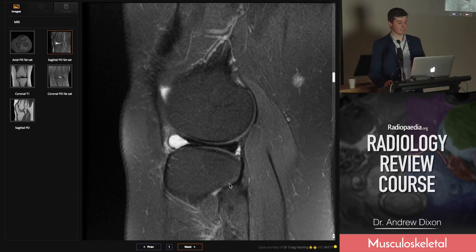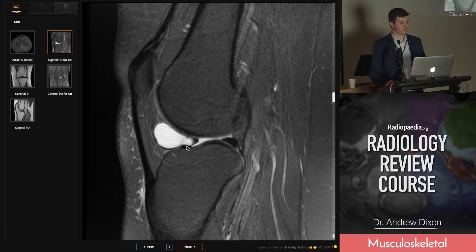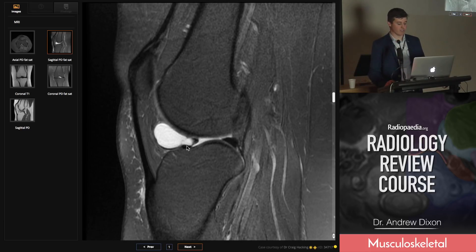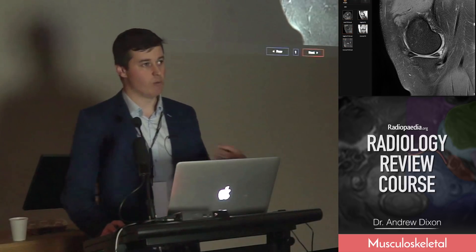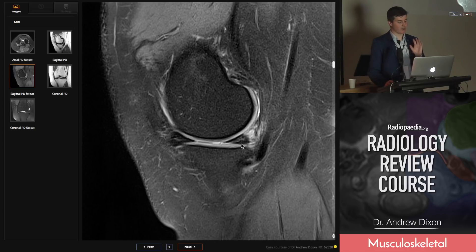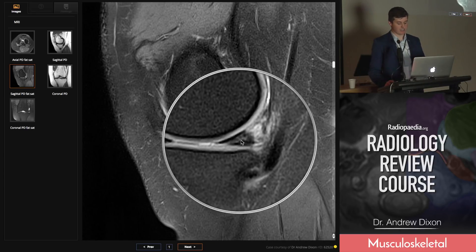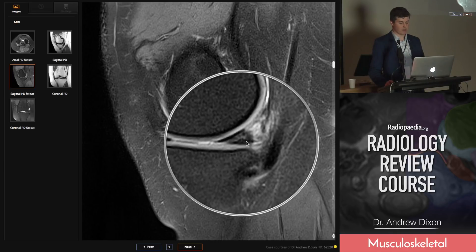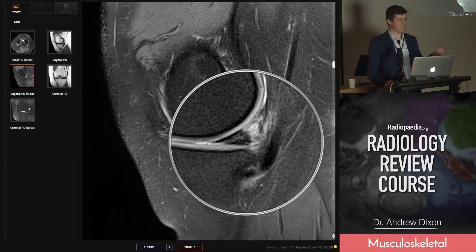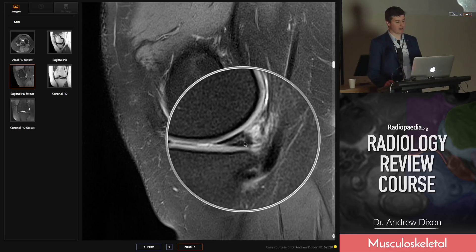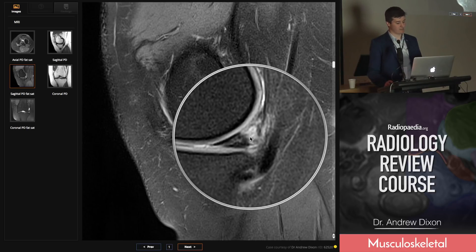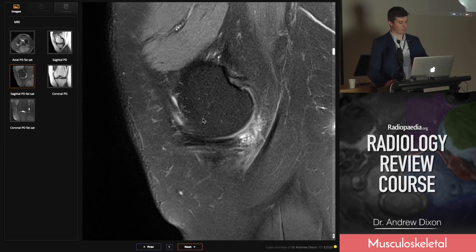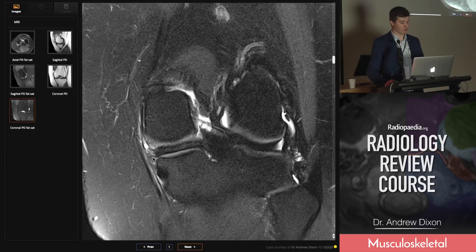Looking at the front of this case, it's associated with a massive parameniscal cyst. Horizontal tears are the ones that tend to form parameniscal cysts, so if you see a parameniscal cyst, think horizontal tear of the meniscus. Horizontal tears are almost always degenerative, and the most common location is the posterior horn of the medial meniscus. You get this linear signal extending from the periphery to the inferior articular surface. Note also the meniscocapsular inflammation and smudgy signal sitting next to it.